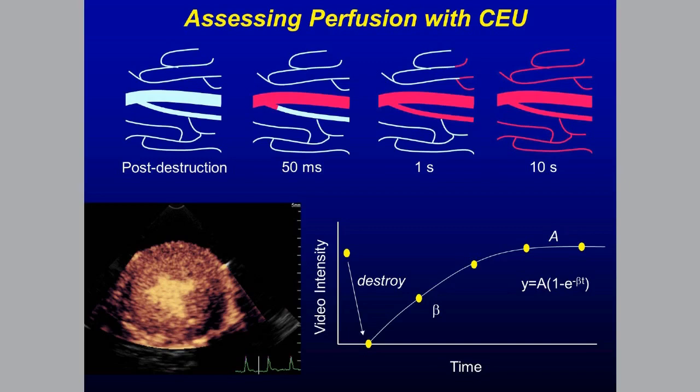Pediatric echocardiographers generally don't use the commercially produced contrast agents very much because, quite obviously, the kids generally have better image quality. There isn't the issue with endocardial dropout. There isn't the question of left ventricular thrombus as often. That being said, with the increasing prevalence of obesity in our pediatric populations, I think that's about to change. But for example, using it to exclude the presence of a thrombus in somebody who has a surgically corrected congenital lesion is something I've seen our own institution use it for.